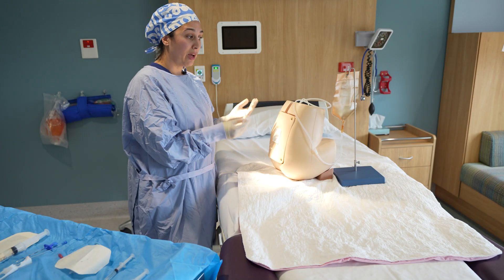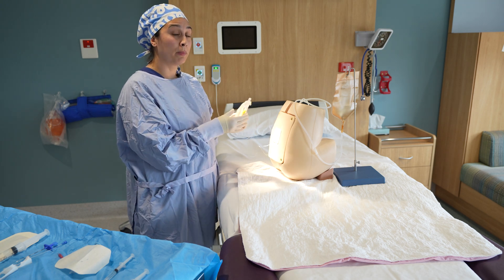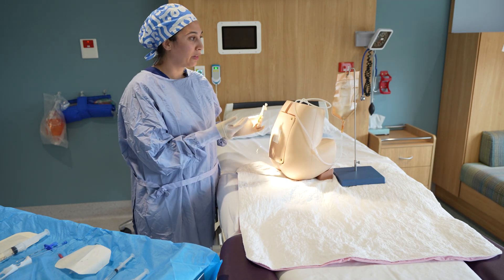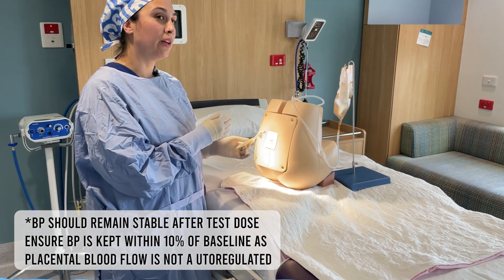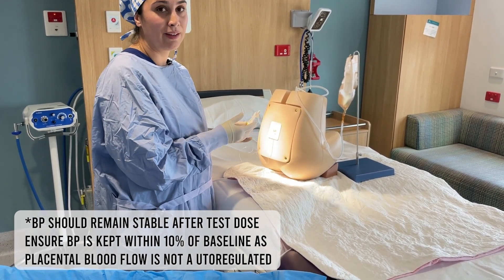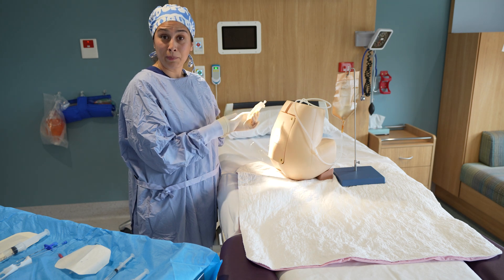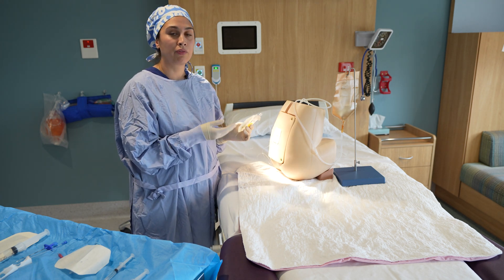Once the epidural is dressed and the patient is back in bed, do a few safety checks: ask the patient to move their legs — they should move normally — and check whether they're feeling okay. If a contraction occurs and feels similar to the previous one, that's reassuring. Explain to the patient that this is a good sign and that contractions should ease over the next few. After these safety checks, proceed to load the epidural with further solution.